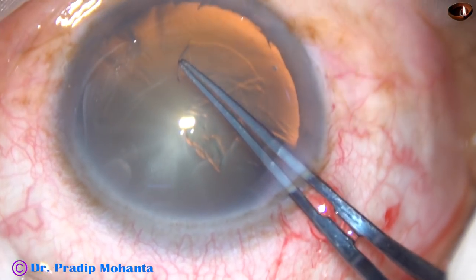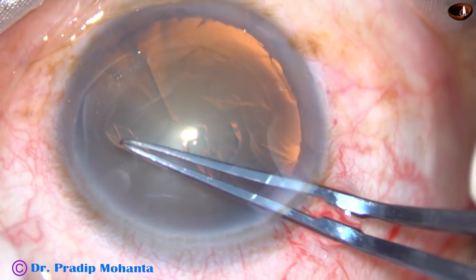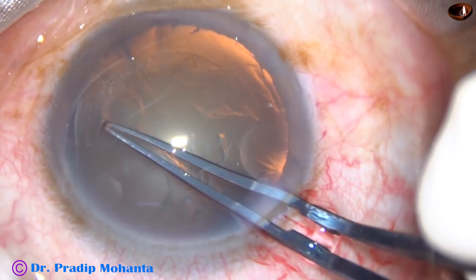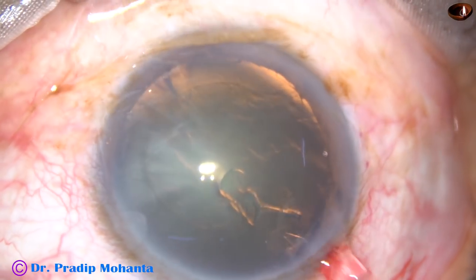Today, Dr. Alexander Zyepdik from Serbia is with me and he is watching this surgery live. So the continuous curvilinear capsulorhexis is done.